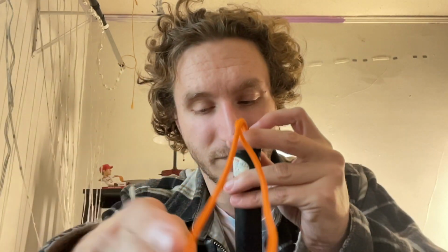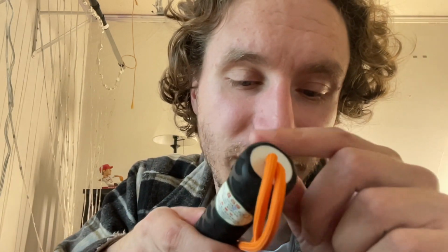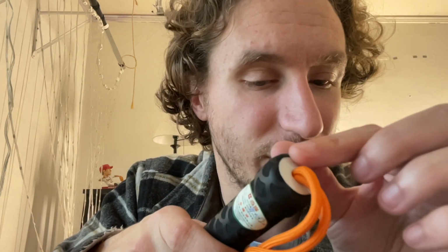Alright, tour time. So, this cane, rather than having the bungee, has almost a softer, I would call it a cross between a paracord and a piece of yarn. I'm not really sure what the material is. It's a little stretchy. It's got a little give to it, but it's not particularly stretchy. Coming down from there, we do have a cap where the rubber of the grip material, which we'll get to in a moment, is kind of over the top just a touch, and so it seems like this piece is pretty well in there. I don't know if it could be replaced or not if something were to happen to the string. And this cane has no loop in the string, and we'll get to why that is in a moment.